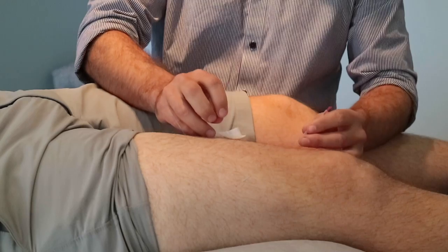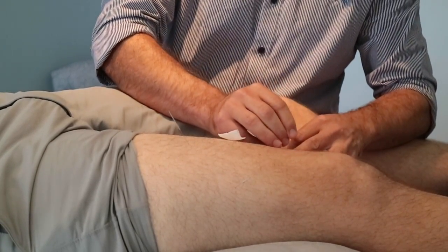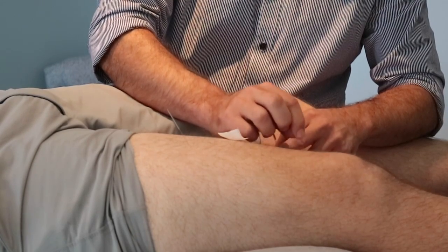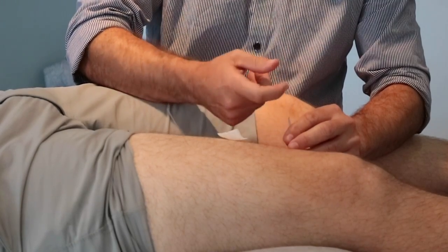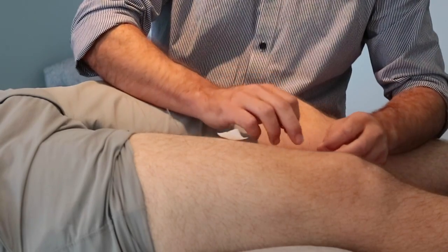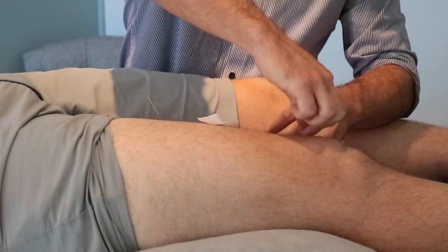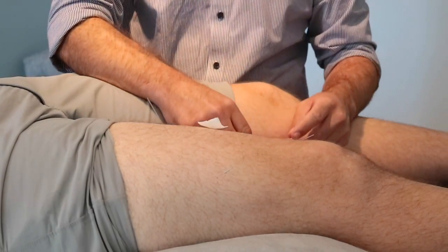They're the ones that we used to like squeezing when we were kids on the bus. You tap it in, and you're going to elicit a really fine twitch, and Dan's is just about to come on. How's that feel, Dan? Alright. Let's move that a little bit more laterally. We just tap the needle in, and Dan's playing silly buggers with me at the moment. I'm very, very close to this trigger point, but it's feeling so smooth that I'm not eliciting the actual twitch that I'm looking for. Okay, so we're going to call it a day on that vastus medialis.